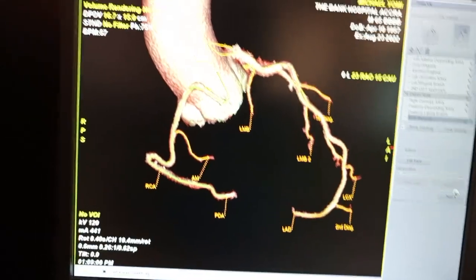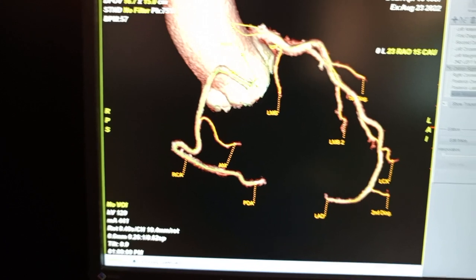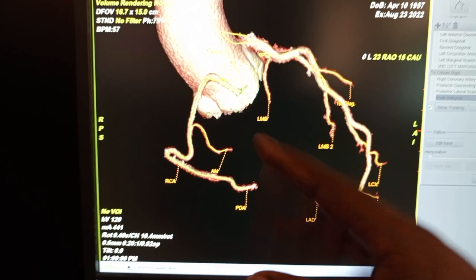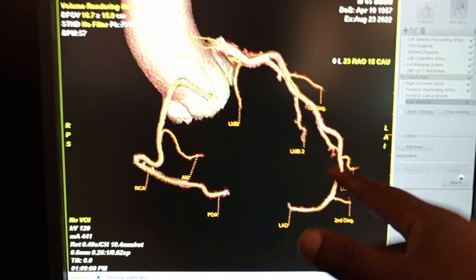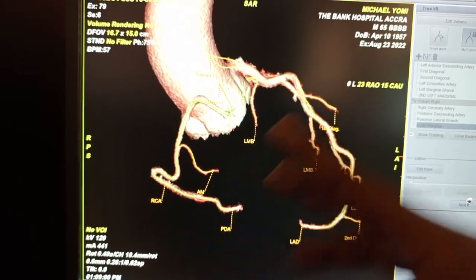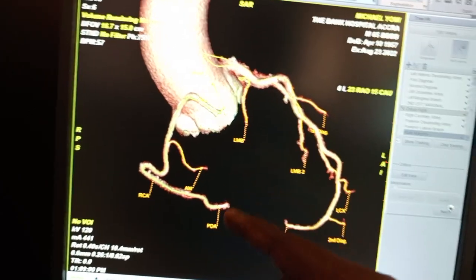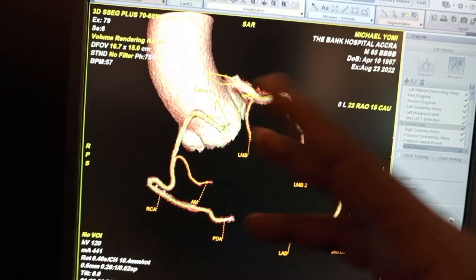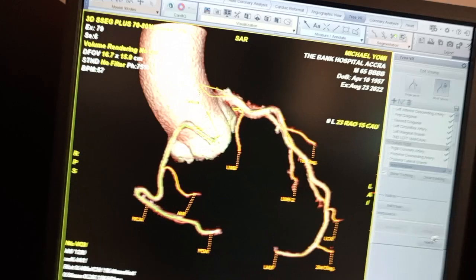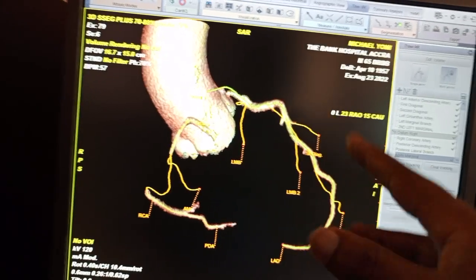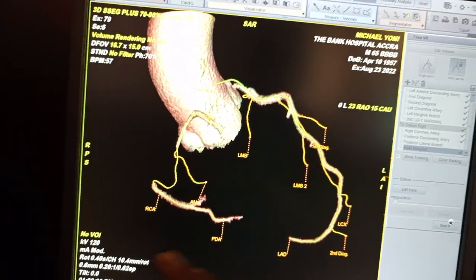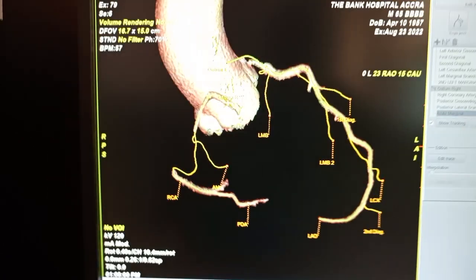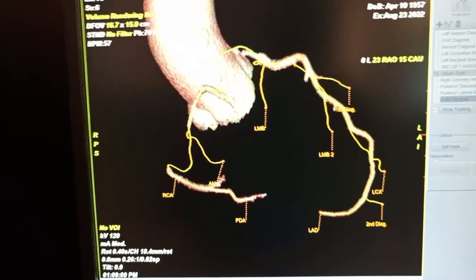It's performing vessel quantifications on all the vessels. It will go through all the vessels one by one and give you the outline. Each vessel that you go through will allow you to measure stenosis, plaque analysis, diameter, and everything. It will take some time.